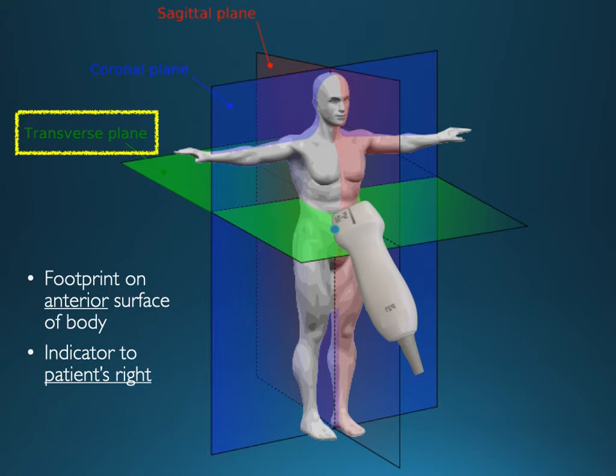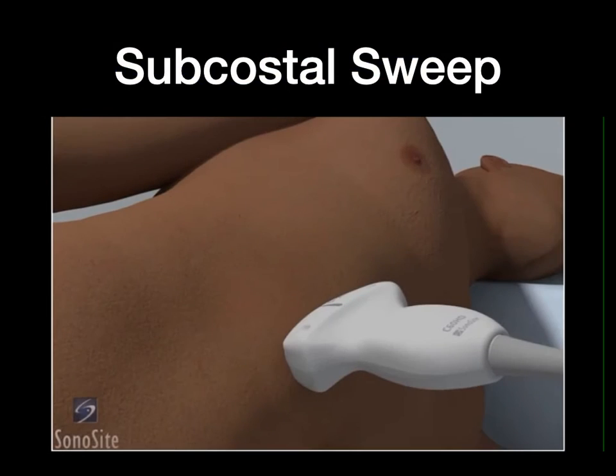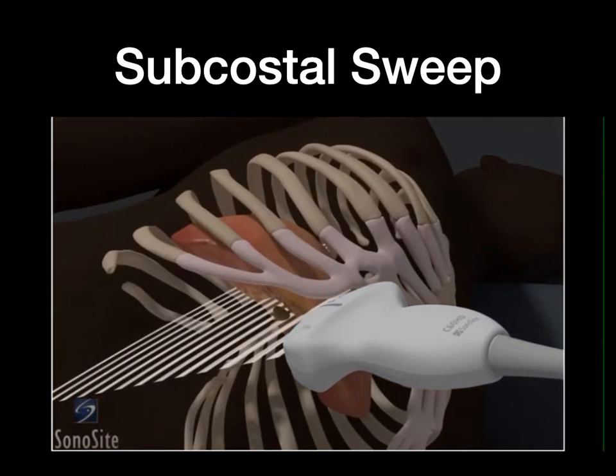As with the imaging of all structures, we will want to see the gallbladder in two planes, so once identified, we will rotate our probe to the patient's right to change into a transverse plane. There are a lot of great videos on how to perform different exams on the Sonosite website, and I encourage you to use it for reference.